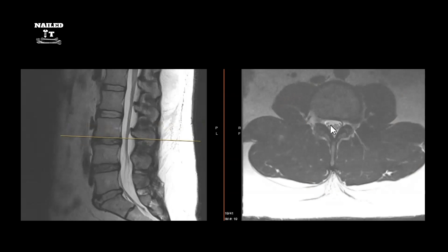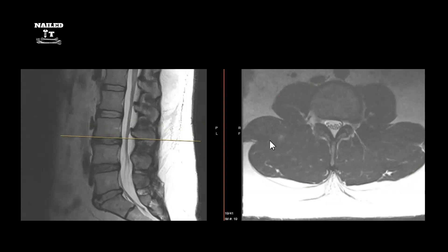You've got your nerve roots, facets, spinous process, and large erector spinae muscles posteriorly. You can tell this is a younger patient because he doesn't have much fat interspersed through the muscles. On older patients, you'll sometimes notice significant muscle atrophy in the lumbar paraspinal musculature — something worth noting.